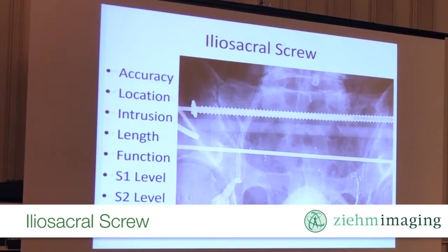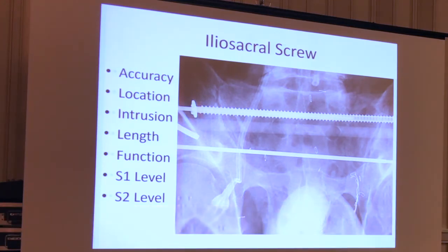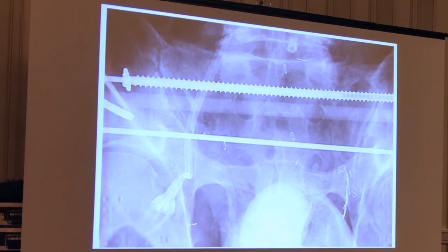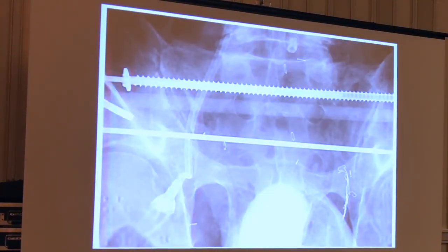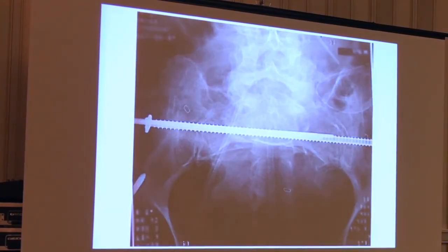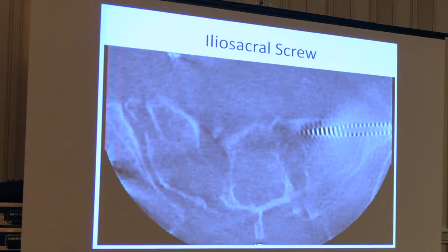This is a much sicker guy. You can see he's got a long line in his right groin, and we were trying to help him by stabilizing his ring. If you look at that transiliac-transacral screw, you can see it's a little bit ascending — it's ascending out the other ilium. The S2 wire looks pretty good, but on the inlet view you can see the S2 wire looks maybe a little bit too posterior. So we went ahead and spun him while we had the wire in this position because it doesn't look good — and of course his wire is almost in his canal, if not in his canal.